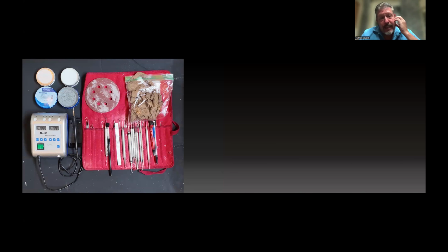So here's my waxing kit. I have all these instruments. I'll show you the instruments I like to use. The waxer I have literally is off of eBay. It's cheap as hell, but it works. There's more expensive ones if you want it. I bought the cheap one because I didn't have money at the time, and I've used it forever.